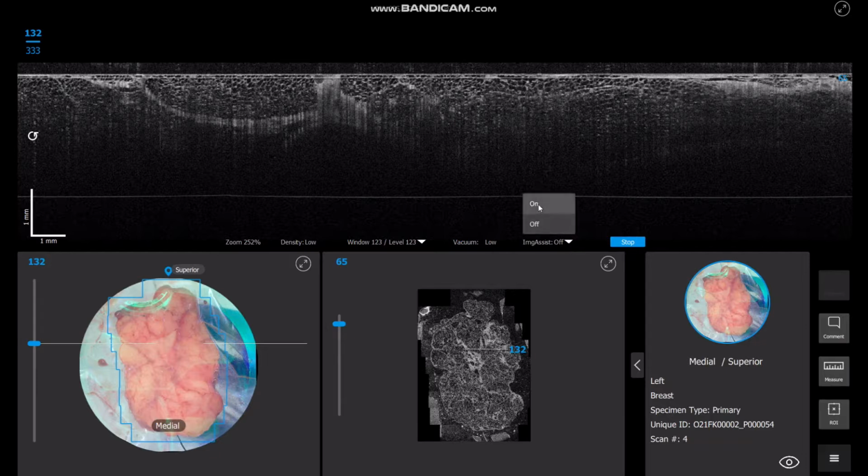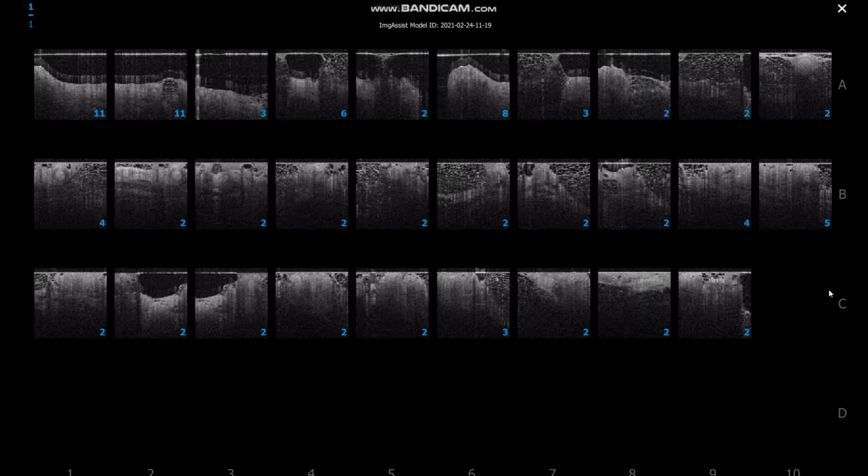And then in the middle, being highlighted just now, that's the sort of image that's being taken by the optical coherence tomography. Now it's scanned across and it's found various thumbnails, highlighting in red just now the thumbnails that are considered to be suspicious, the ones in blue less so.